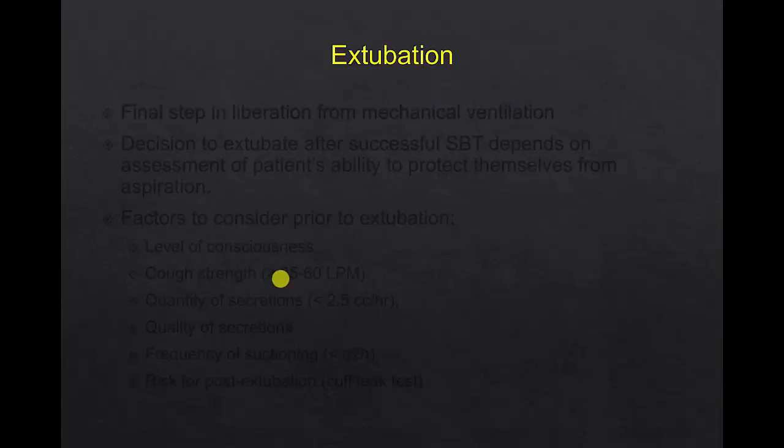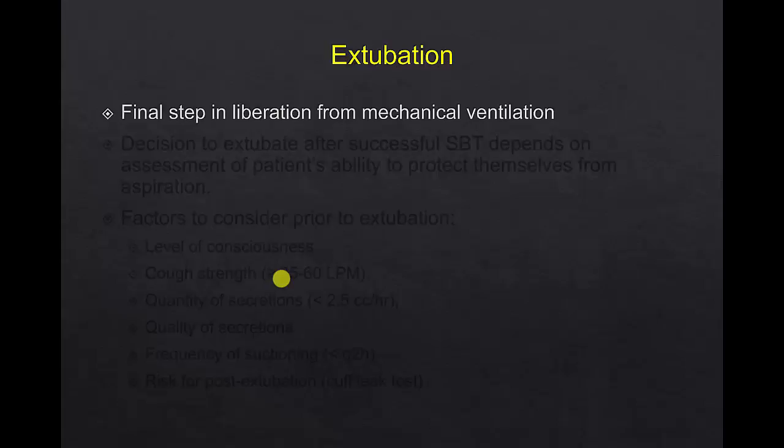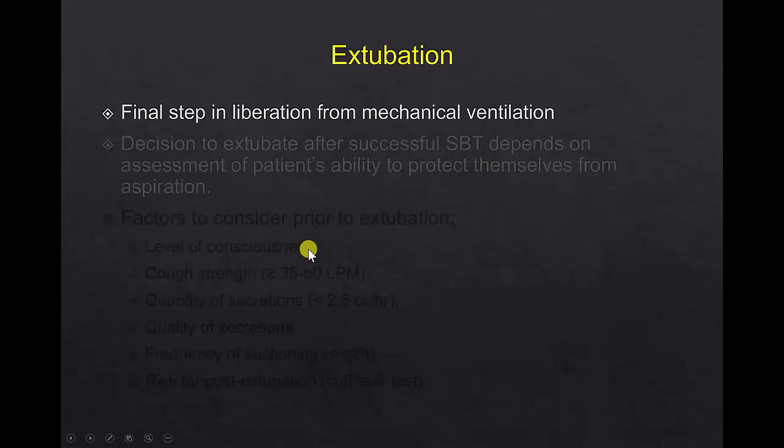Once somebody has been weaned from the ventilator and is independently breathing through the circuit with minimal support, we want to consider extubation. There's really no hard science as to extubation criteria. It's really years of experience and some very basic observations about chances of success of extubation. We know that if we wait till we're 100% sure someone's fine, we'll be prolonging extubation. So whenever we extubate someone, we're taking a small chance that they'll need to be reintubated. We're just trying to minimize the chance of reintubation.